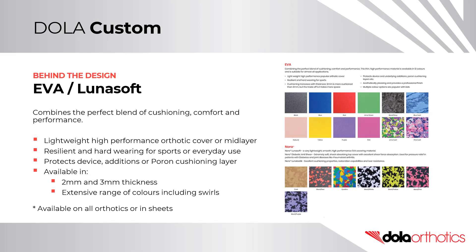EVA and Lunasoft are available in 2mm and 3mm thicknesses, and in an extensive range of colours, including swirls that are very popular with children. They are available on all custom orthotics, prefabricated orthotics, or in sheets.